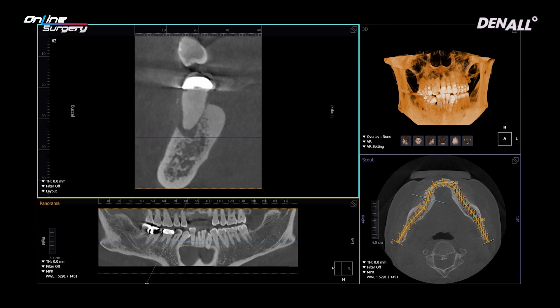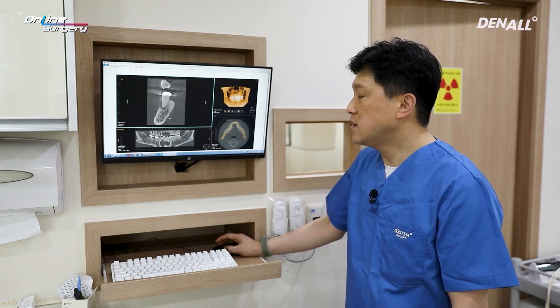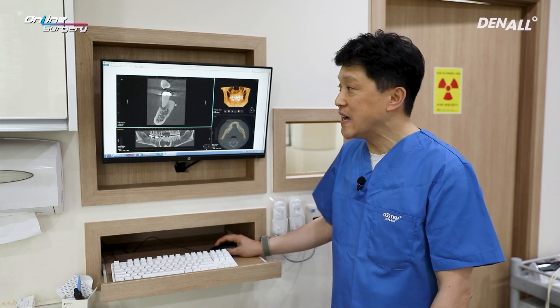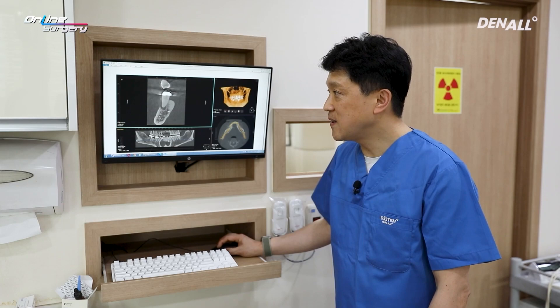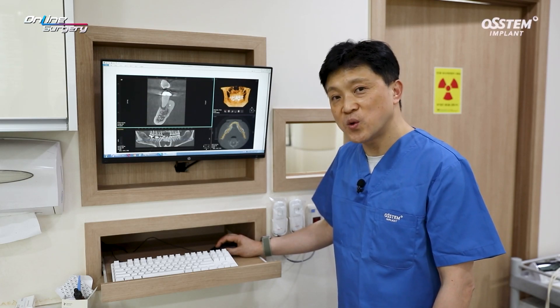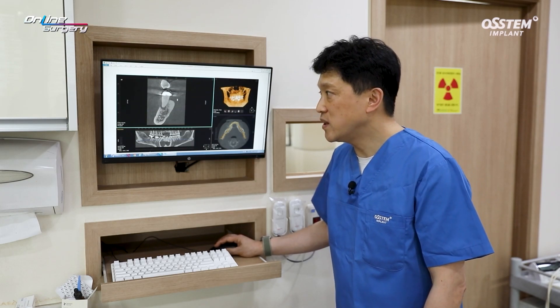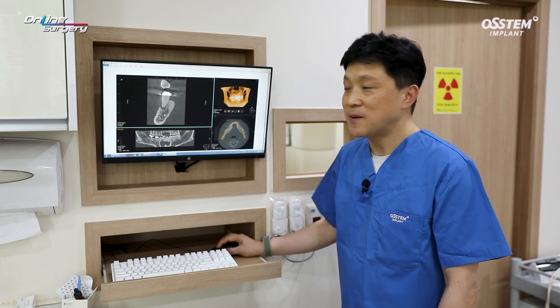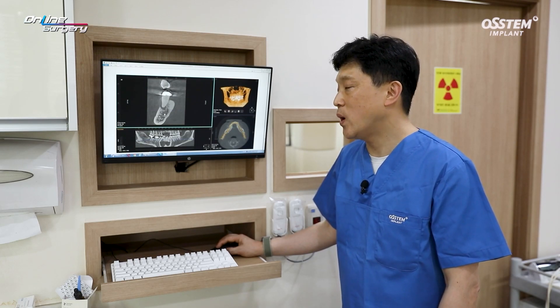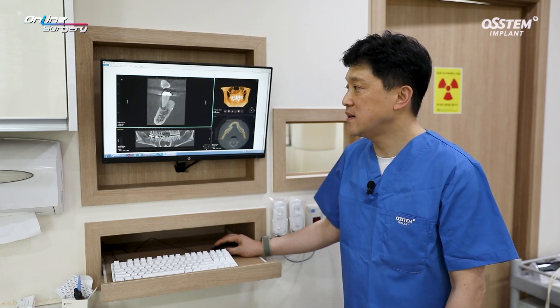If you look at the CT, you can see bone loss around the mesial and distal root. When we look at this kind of CT, the precaution we need to take is that on the lingual side, the cortical bone is very hard. Because of that, when drilling is performed, it is very difficult to drill towards the lingual side and there is a high possibility that the drill will deviate towards the buccal side because there is less resistance there. We need to think of this ahead — there is a difference between knowing about it and not knowing about it.